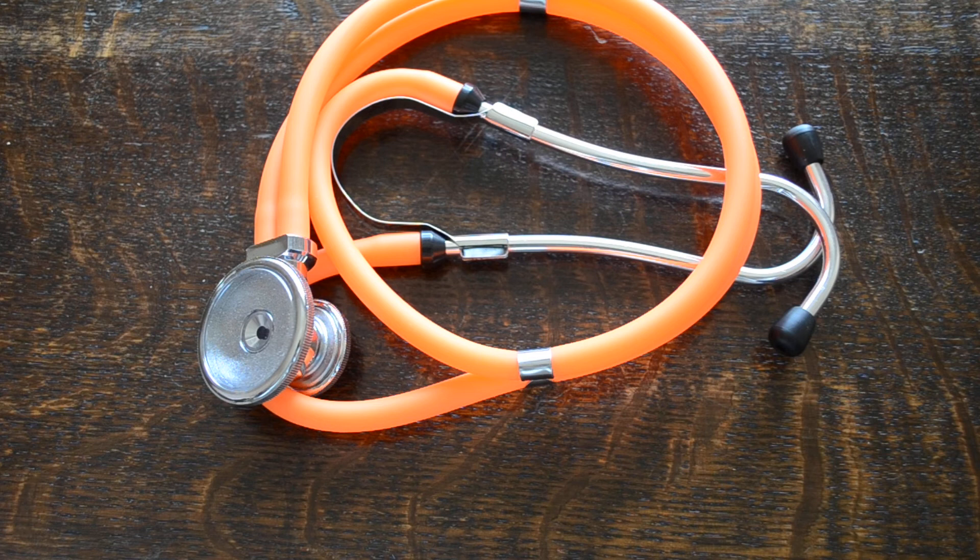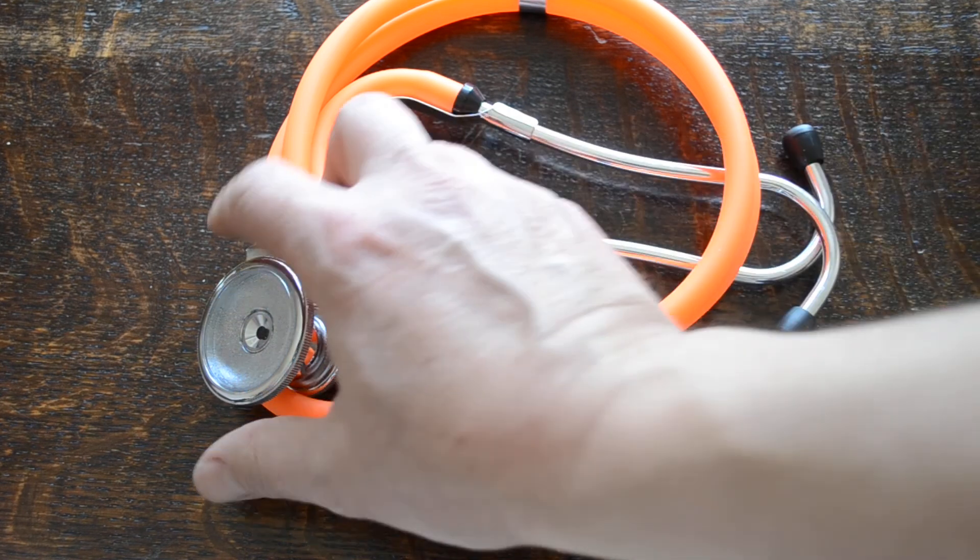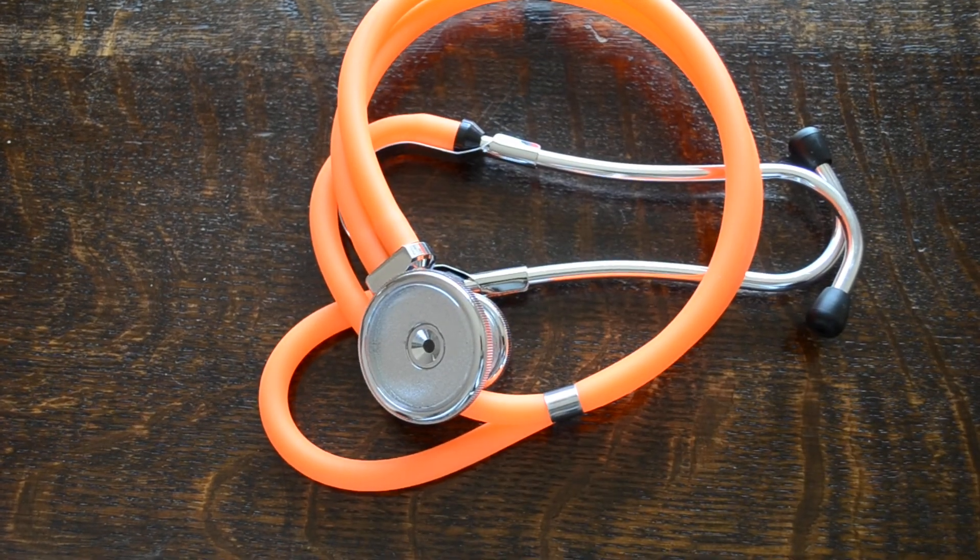So that's the Sprague Rappaport with orange tubes available from Valumed. The price of these units currently they're on offer at just under £10. With delivery you're looking at £12 to £13 delivered in the UK and that's going to give you really good quality stethoscope for under £15 delivered.